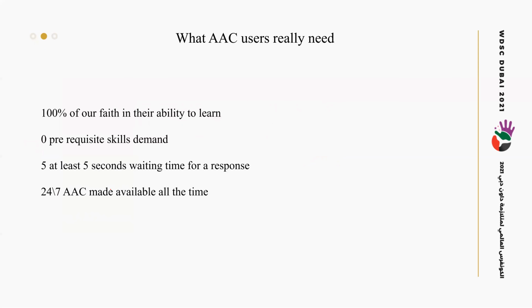When we use AAC devices with a student or any child, we want to be careful and give space for the user to reply to us or respond to messages. Here are some points the user really needs when someone talks to them. 100% faith in their ability to learn.